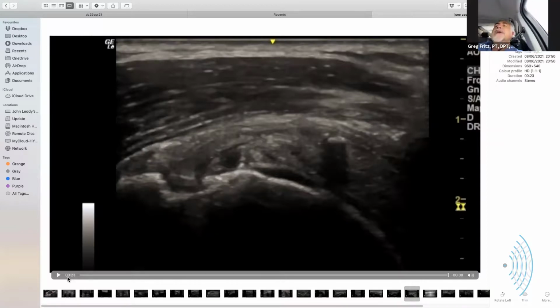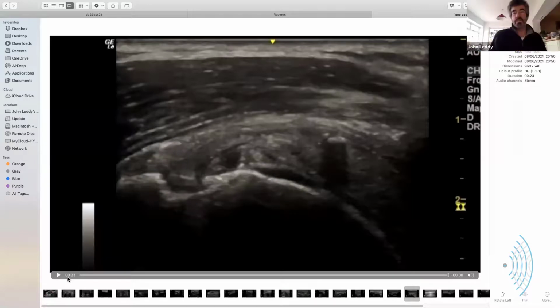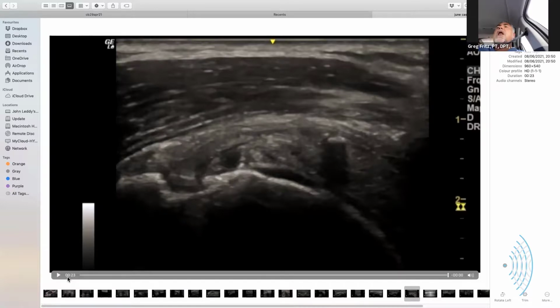Oh, hang on. You said this way, but I'm having a bad view from here. Say it again. Yeah, so I've scanned them in this position, or on the back of the chair. If I'm struggling to see infraspinatus, I often put the hand behind the back. Bring it round, like a full crass. But I do that for infraspinatus rather than for supraspinatus generally.